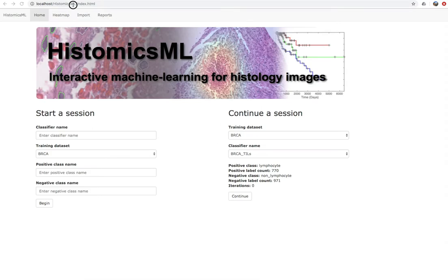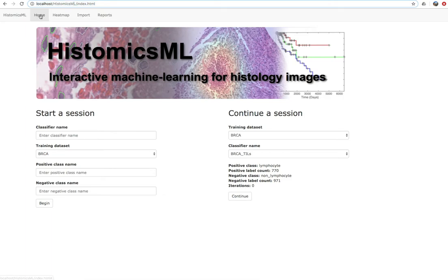Histomics ML2 is accessed through your web browser. If running the quick start container on your local system, Histomics ML2 is located at the local host address. The top of the landing page provides access to menus for training, visualization, and for importing and exporting data sets.